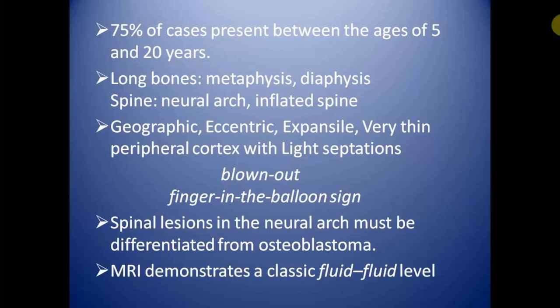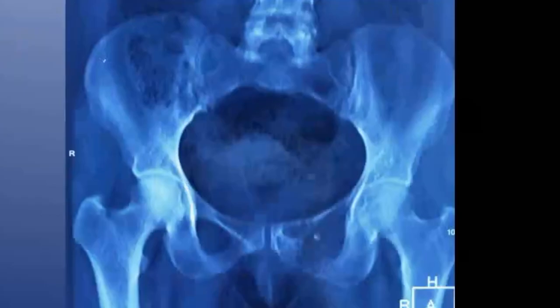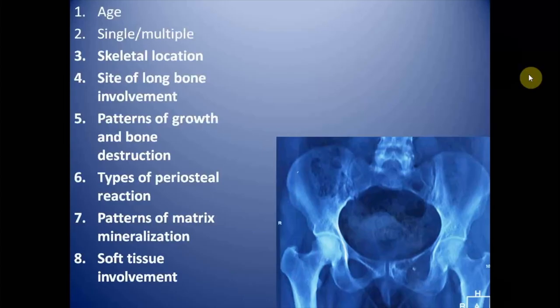This is the case of a 45-year-old female who presented with swelling in the region of the gluteus and greater trochanter for two months. This is the frontal radiograph of the pelvis covering both hip joints and we will review this lesion on the basis of systematic subheadings.